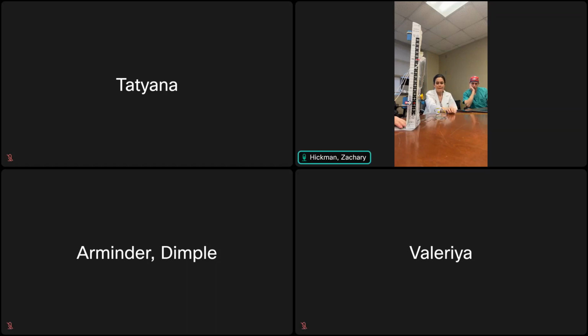And then if the EVD isn't working, and you follow the EVD, okay, proximal, it looks like it's okay. Nothing is soaked. Everything is open as it should be. What do you do next?